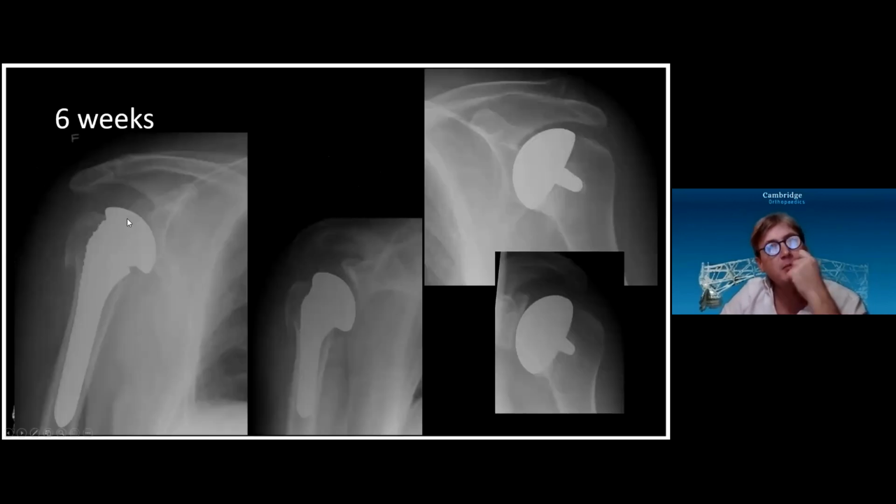And so on that right-hand side, because the head was dead and the patient was in their 70s, I've gone for a hemiarthroplasty and a stemmed arthroplasty because greater tuberosity and lesser tuberosity have been disconnected from the shaft. I need something to anchor it on. You might notice the anchor at the back. I stretched out all the posterior structures. So here I've done a posterior remplissage of infraspinatus and of that posterior capsule, because recurrent instability can be a real problem, particularly if they're still fitting, if they're still having seizures.